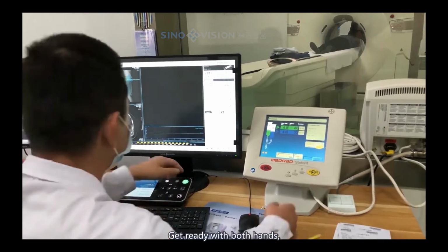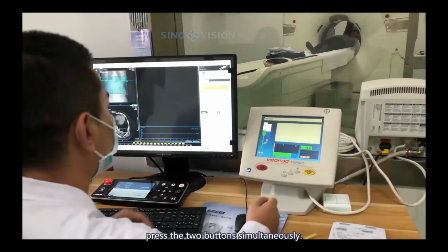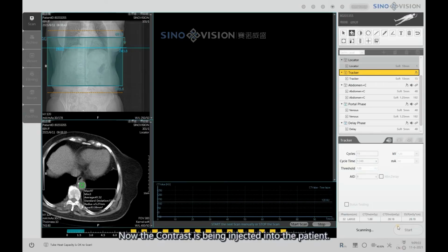Get ready with both hands. Put one hand on the CT box Start Exposure button, and the other hand on the injector Start Injection button. Once the systems are ready for both scanning and injecting, press the two buttons simultaneously. Now the contrast is being injected into the patient.